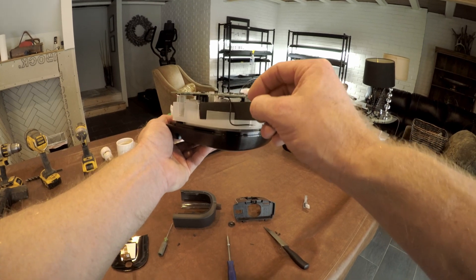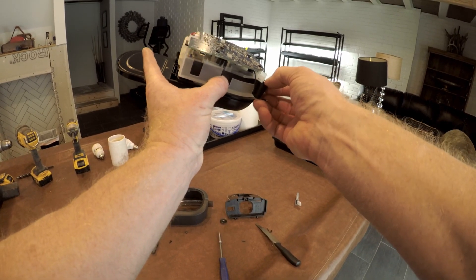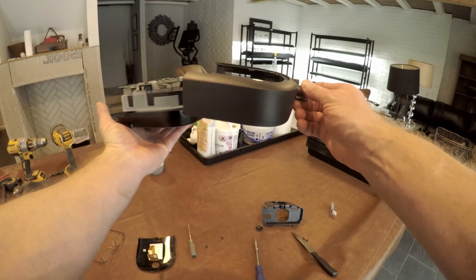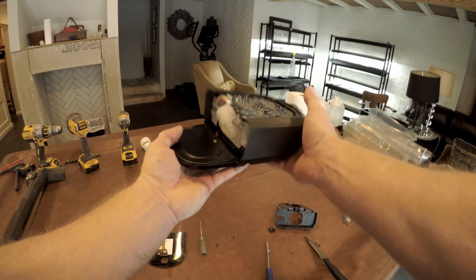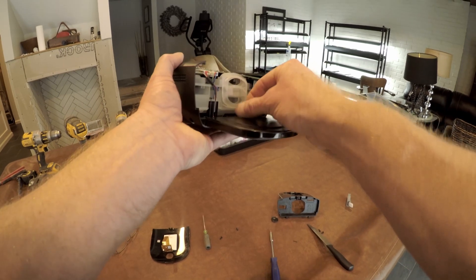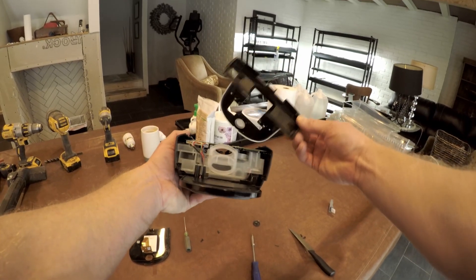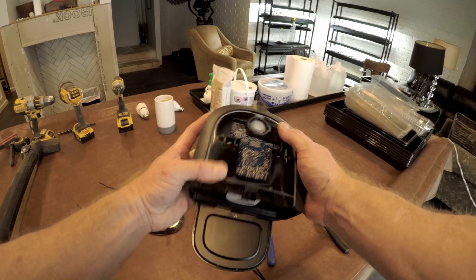Then we'll just put it all back together the same way we took it apart. The antenna I just stuffed back into there, and tuck the coax cable in out of the way, and then put it all back together. This top piece kind of rocks back into place. The screws on the bottom are what attach to this piece.